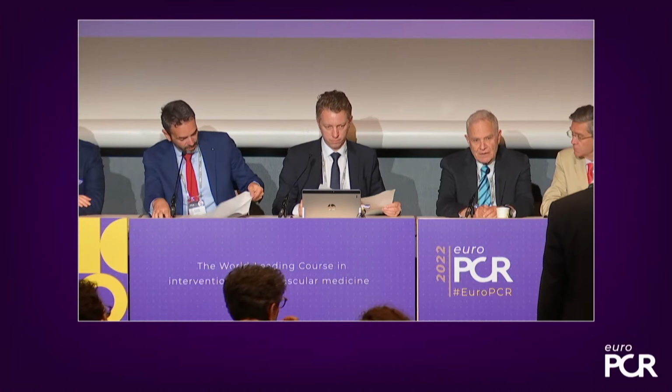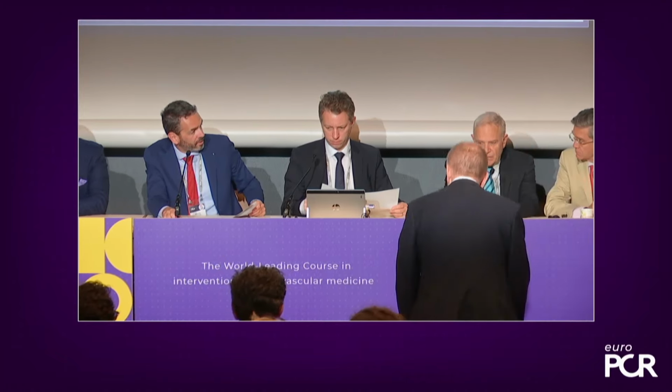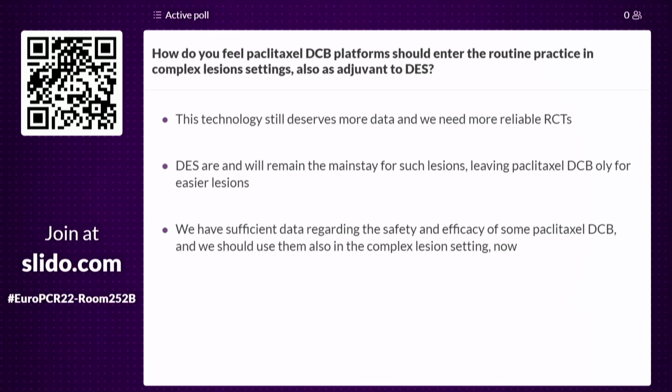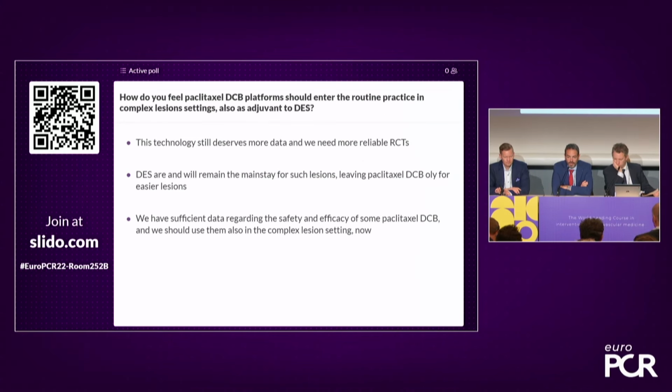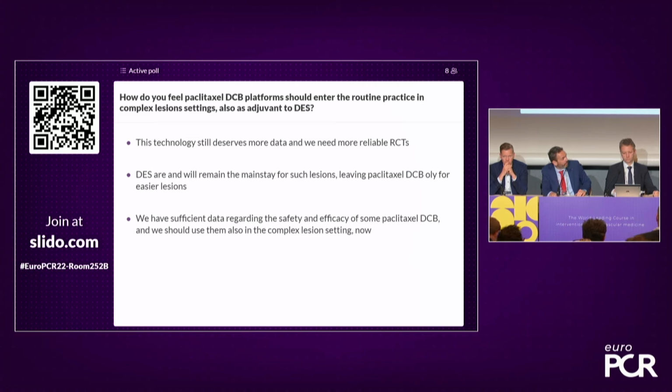Okay, now we have the second part of the discussion. I would like to launch the poll and then ask Fernando for a comment on the case that we have just seen. The question is, how do you feel Paclitaxel DCB platforms should enter routine practice in complex lesion settings, also as an adjuvant, blended with drug-eluting stent? First, this technology still deserves more data, and we need more reliable randomized clinical trials. Second, DES are and will remain the mainstay for such lesions, leaving Paclitaxel DCB only for easier lesions like side branch or in-stent restenosis. Third, we have sufficient data regarding the safety and efficacy of some Paclitaxel DCB, and we should use them also in the complex lesion setting, again also as adjuvant therapy to drug-eluting stent. Please vote. And Fernando, can you comment on the case?